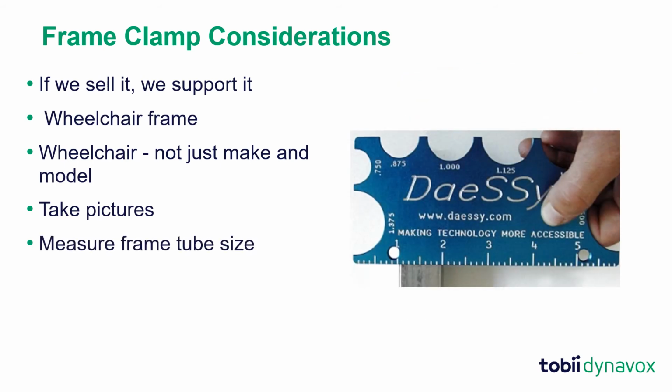And just as importantly, keep a measuring tool with you to ensure the proper frame clamp size is ordered. Measure the tube size and document these measurements in your notes.